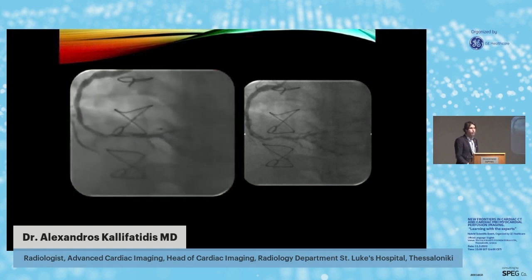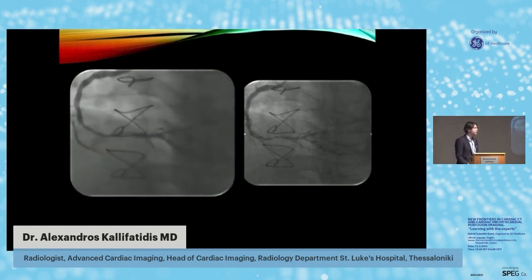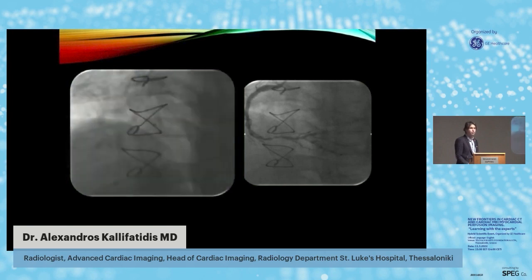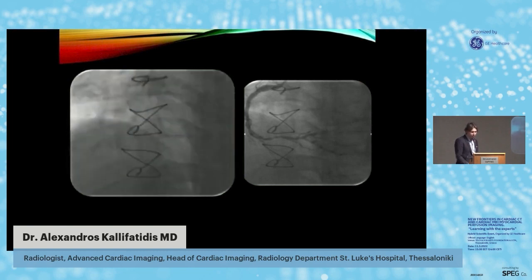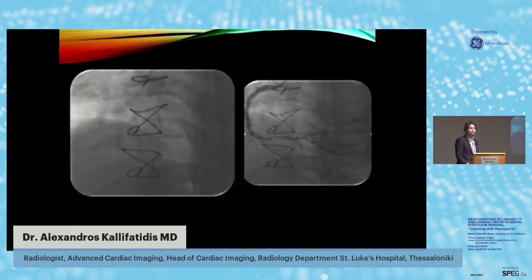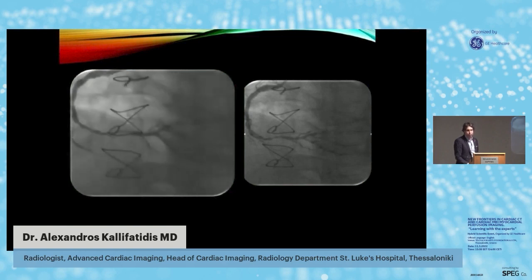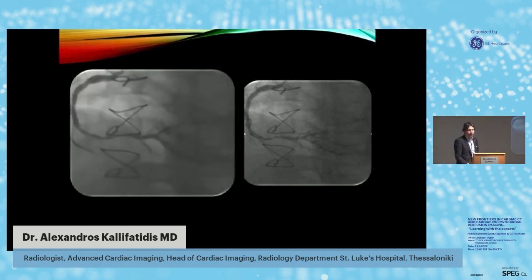So we can see how we can use this technique even in this category of pathology with three-vessel disease. We can nicely see, even visually, these perfusion deficits. Of course, as I mentioned before, with perfusion quantification, a newer technique, we can have numbers and calculations. I don't know if Kostas Kasapidis is with us, and if Kostas, you would like to make a short comment, now or afterwards, about the quantitative perfusion technique.